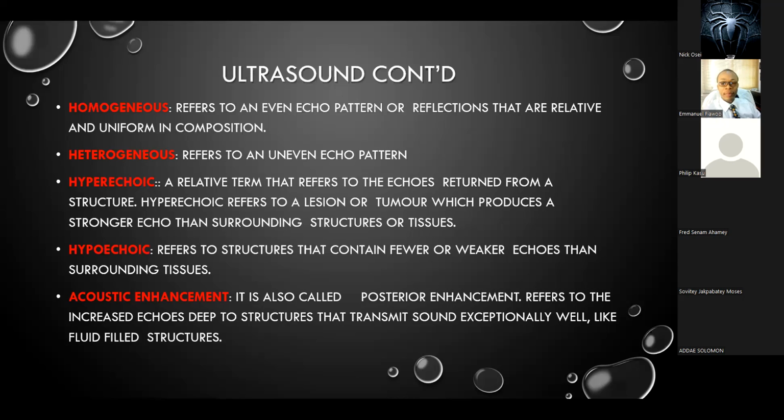Now, hyperechoic and hypoechoic. This is a relative term, and I think I've explained this already.